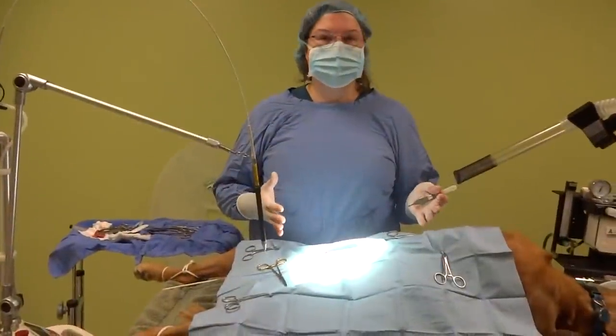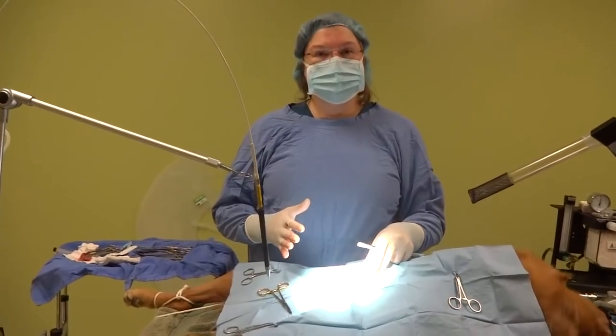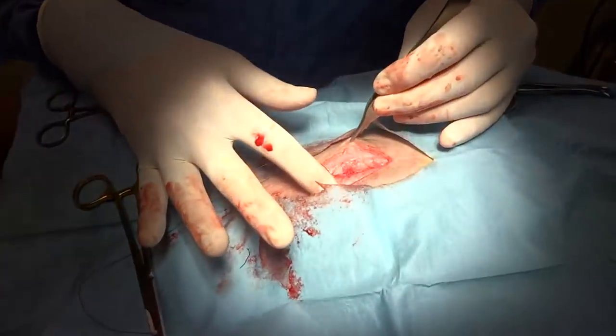We have removed Zoe's ovaries and uterus after tying off those ligatures, and as you can see there is very little blood loss.